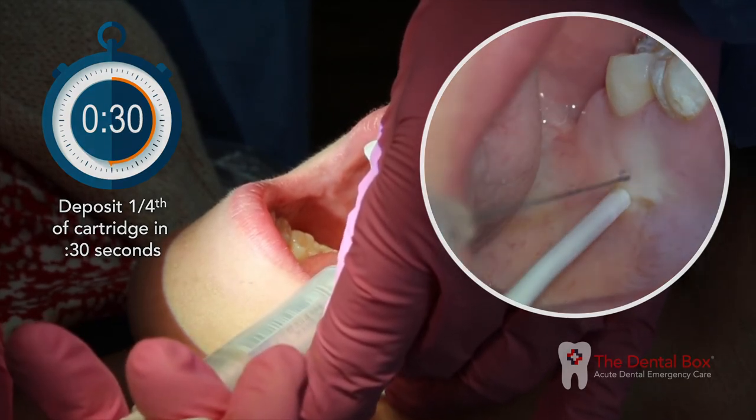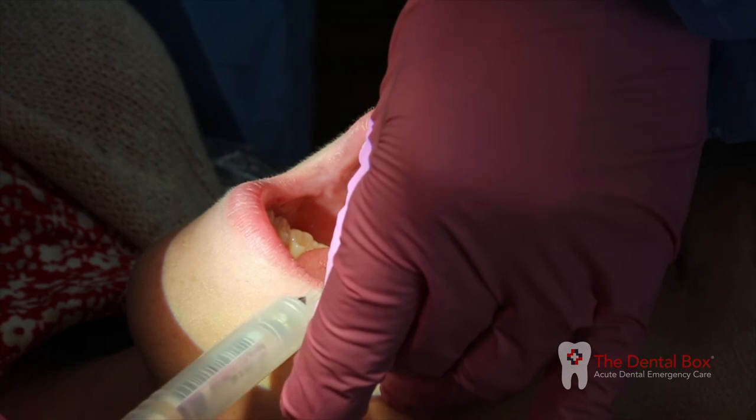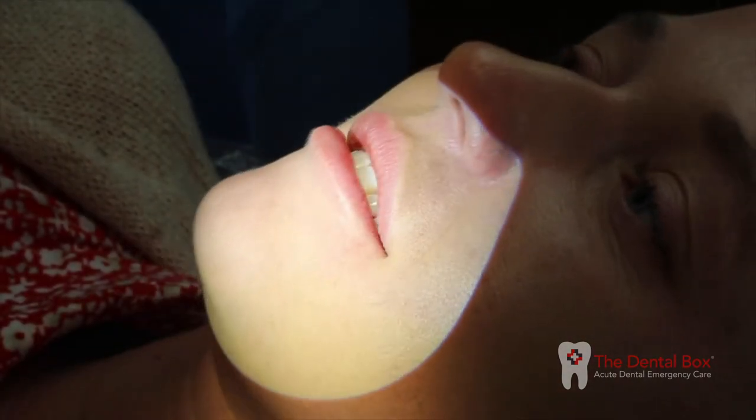Withdraw the syringe. Cap the needle. Wait two to three minutes for soft tissue anesthesia to set in.